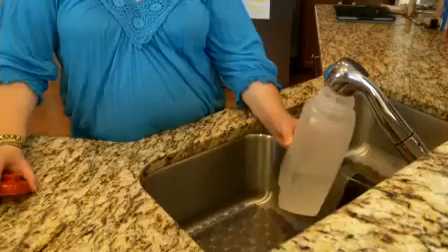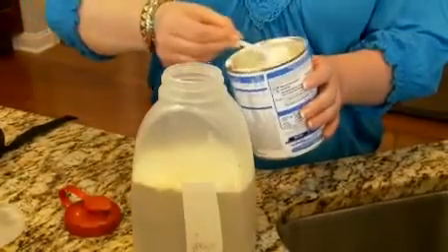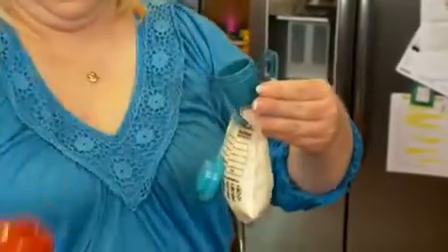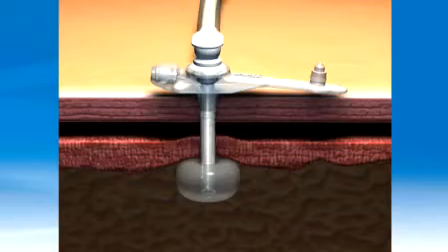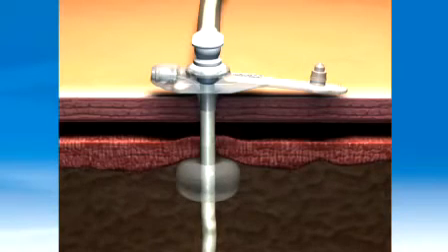These nutritional formulas are either commercially available or homemade using a food processor. A physician will prescribe the proper feeding procedure, formula, and amount of water for effective feeding. A feeding tube, like AMT's MiniONE Balloon Button, is used for people who cannot swallow food through their mouth or are unable to get the proper amount of nutrients to meet their current needs.